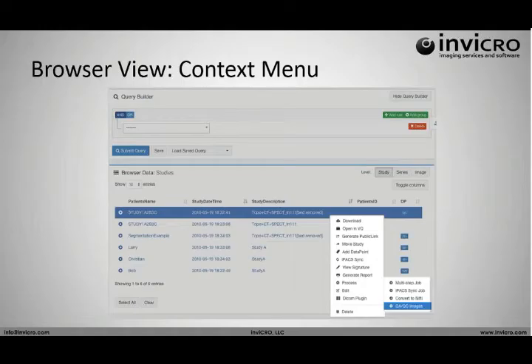The final component for the browser is this context-based right-click menu, which was there in the earlier version as well, but has been rewritten for the new UI. In particular, that little process line, the fourth up from the bottom, is the way that you would kick off external jobs. So, for example, Sarah's processing pipeline job, which creates this report, would be run from here.